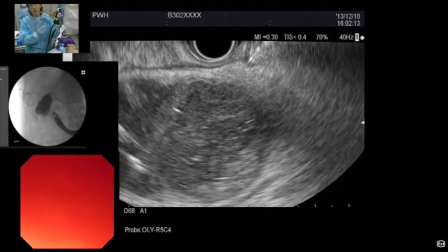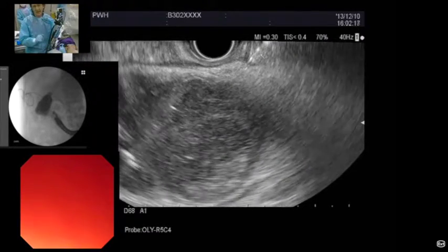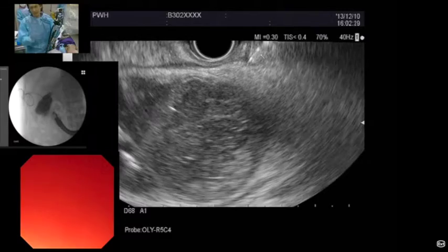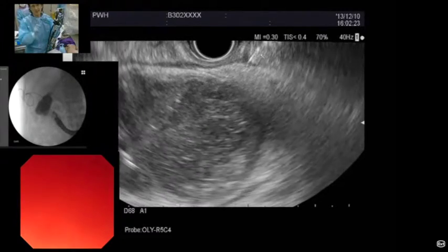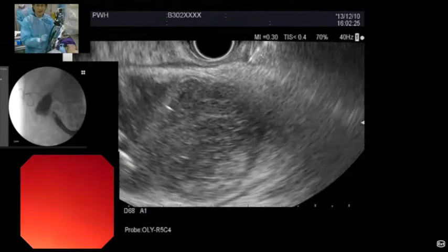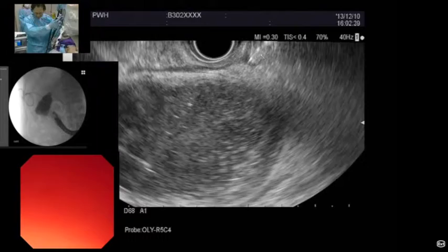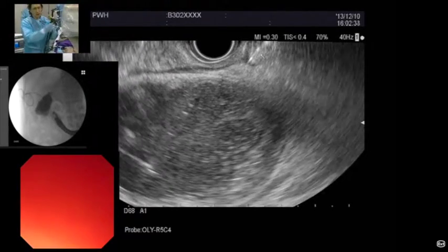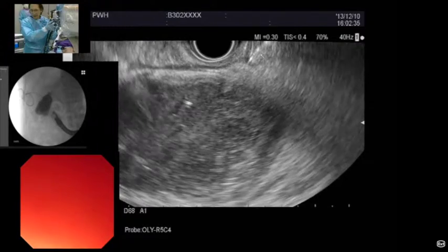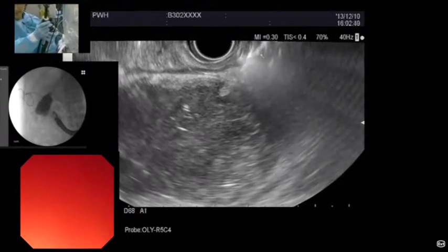All right, now, did we preload with the, yeah, there's really no need. I mean, one can preload this with a guide wire. There isn't a need for that. But if we do a bile duct case maybe tomorrow, then in that case we like to preload with a guide wire and advance the guide wire after we're inside of the target. All right, so I'm going to have you hold this again, and we're ready to go. Okay, so I'm using a pure cutting current here to go in, and it's 100 watts, effect 5, and we're ready to go.